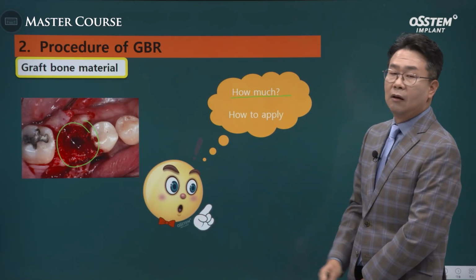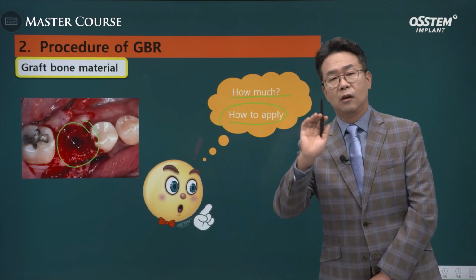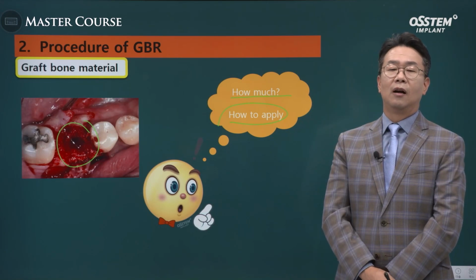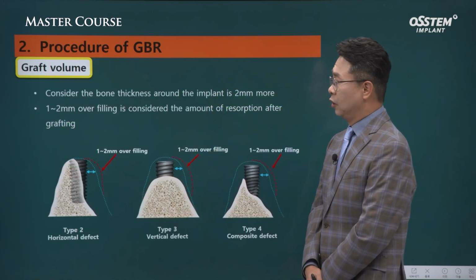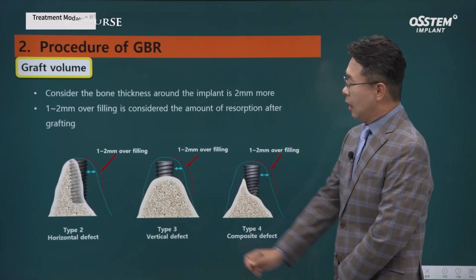How much bone graft do you think should we apply? And how should it be applied? This is the question that comes to mind. How much and how to apply them? First, we need to look at the bone defect.